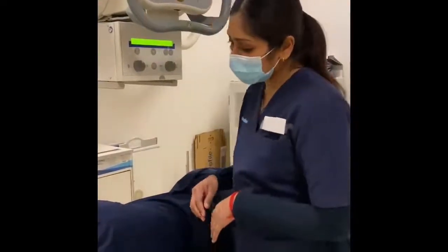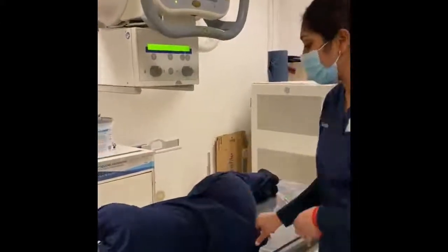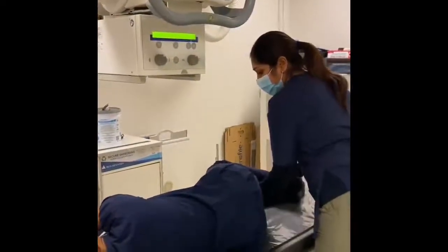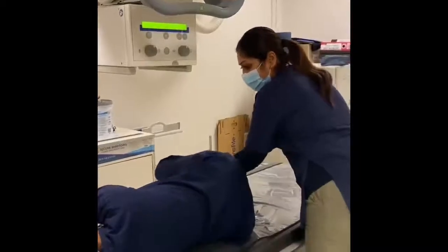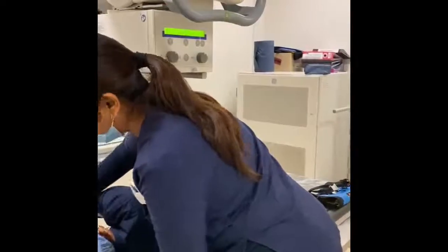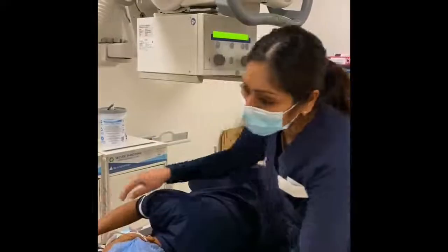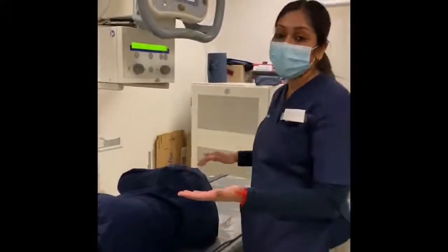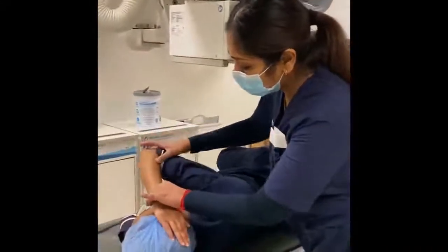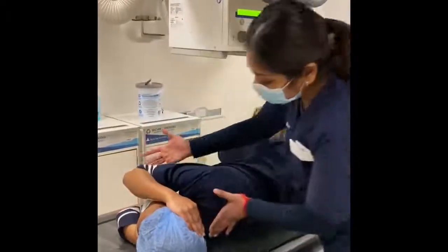Okay, so our patient is in a lateral recumbent position. I'm going to ask our patient to flex the knees slightly. Let's just push your knees up a bit. Okay. And then we need to put our arms. So I just tend to put the left arm under her head. I just feel like it really helps to even out the spine and to give us a nice lateral view. And then I place the right hand on the top of the head, and I just flex the elbows. They should be at the same level.